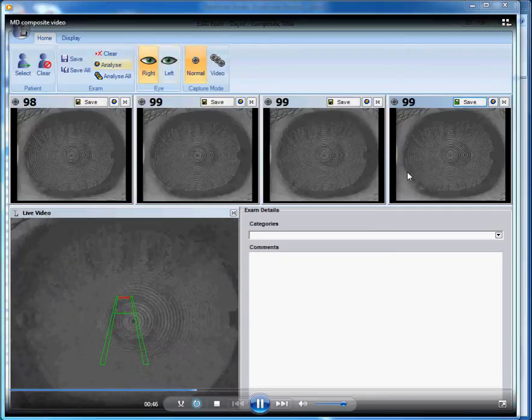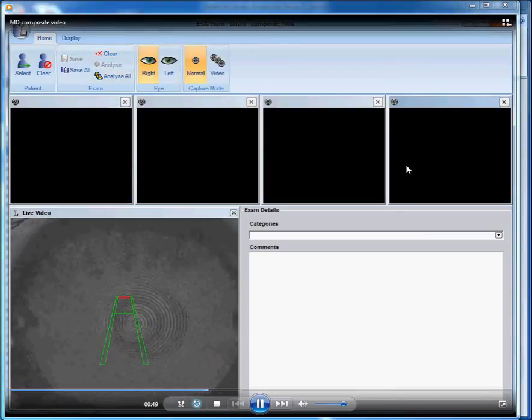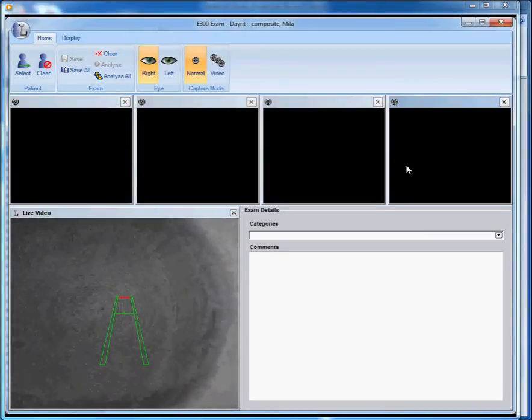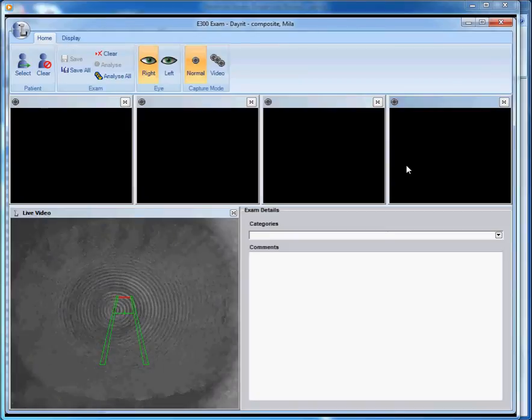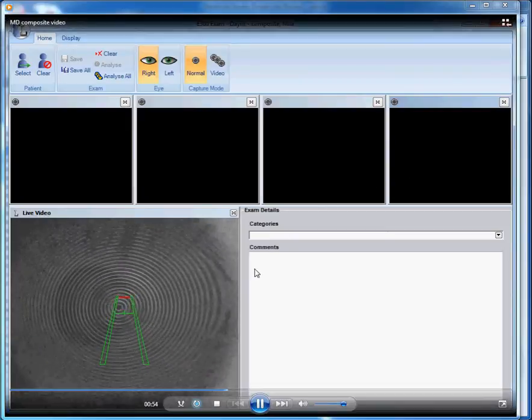In this case, we've now pushed the rings to the temporal side. Once we've saved that image, we can go on and take our next image.